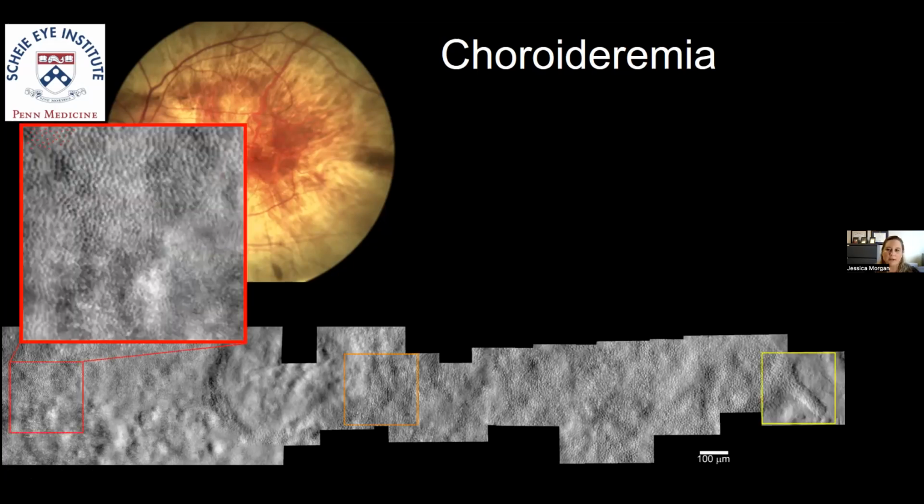So if I just zoom in, I can show you some structural images of the photoreceptor mosaic within this region. This is, again, that central foveal region. You can see the cones are tightly packed within this retained mosaic. I've identified individual cones in the top left corner of this image, just to give you an understanding that if we see the cones, we can identify them and use those identifications to quantify the image into metrics that can come out from these images.